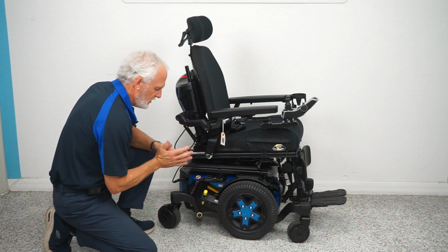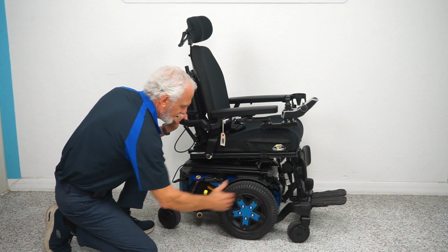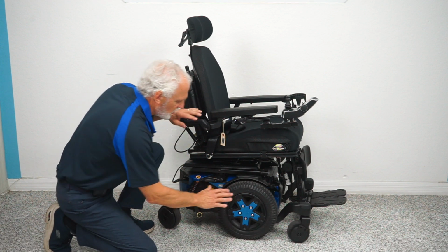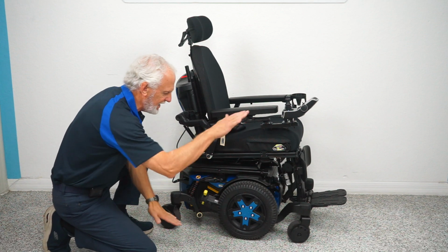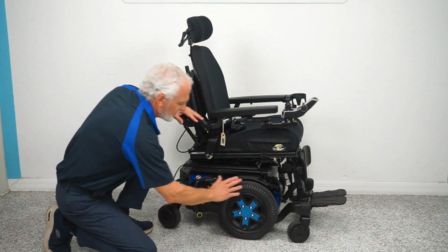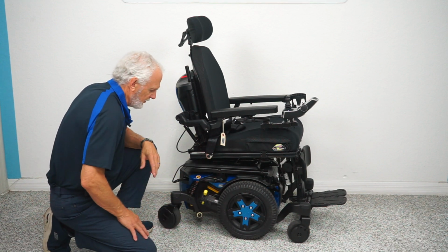This is a mid-wheel. What that means is mid-wheel drive means your drive wheel is going to be in the middle of the front and back. It might not be exactly in the middle, but it's considered a mid-wheel. With a mid-wheel, you're always going to have a fork in front with a wheel on it and a fork in the back with a wheel on it to keep that suspension and that nice turning radius. These are 14-inch wheels. They're not going to mark your floor, same as the front and back wheels.